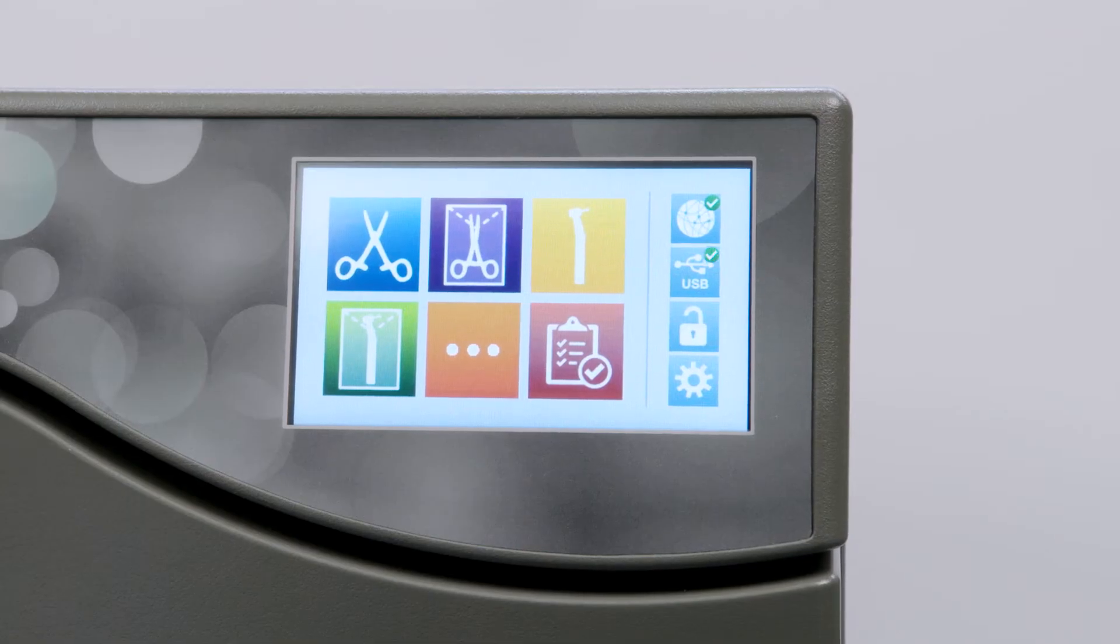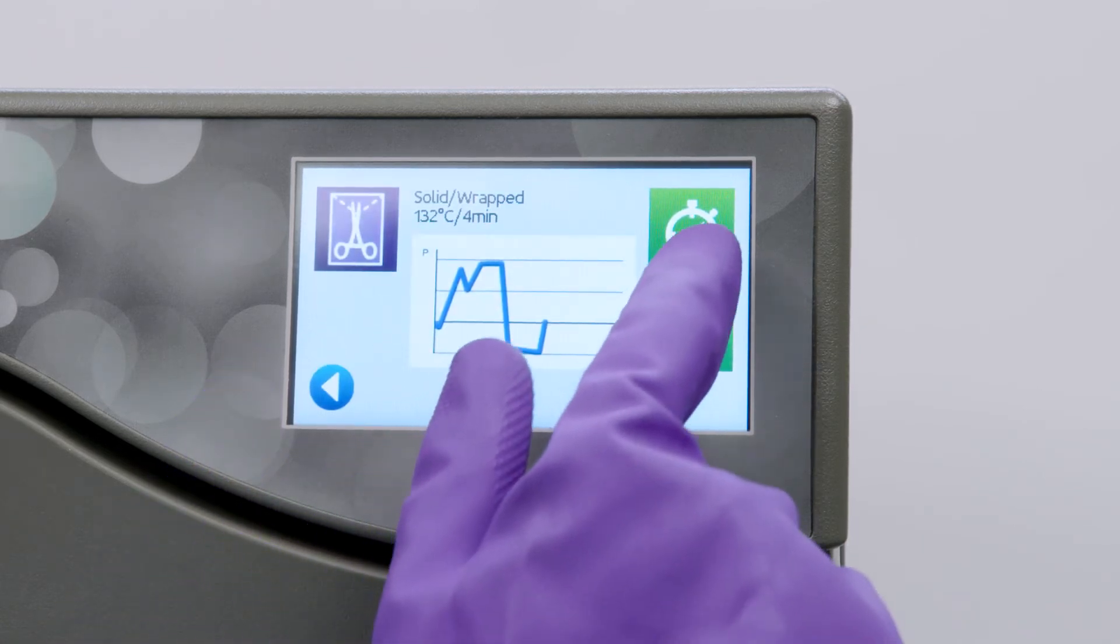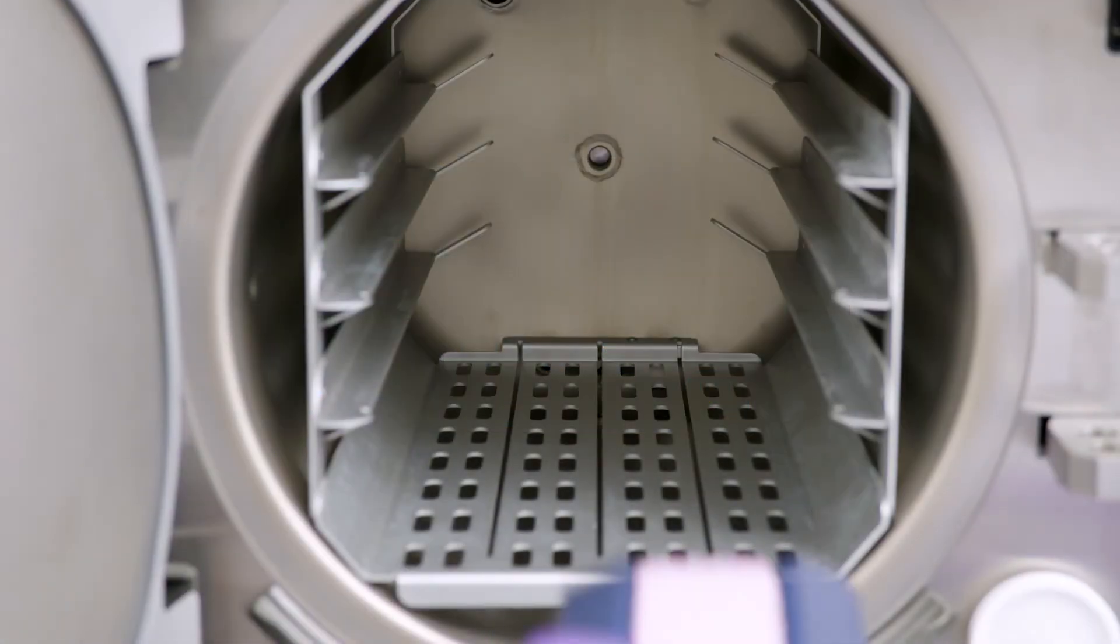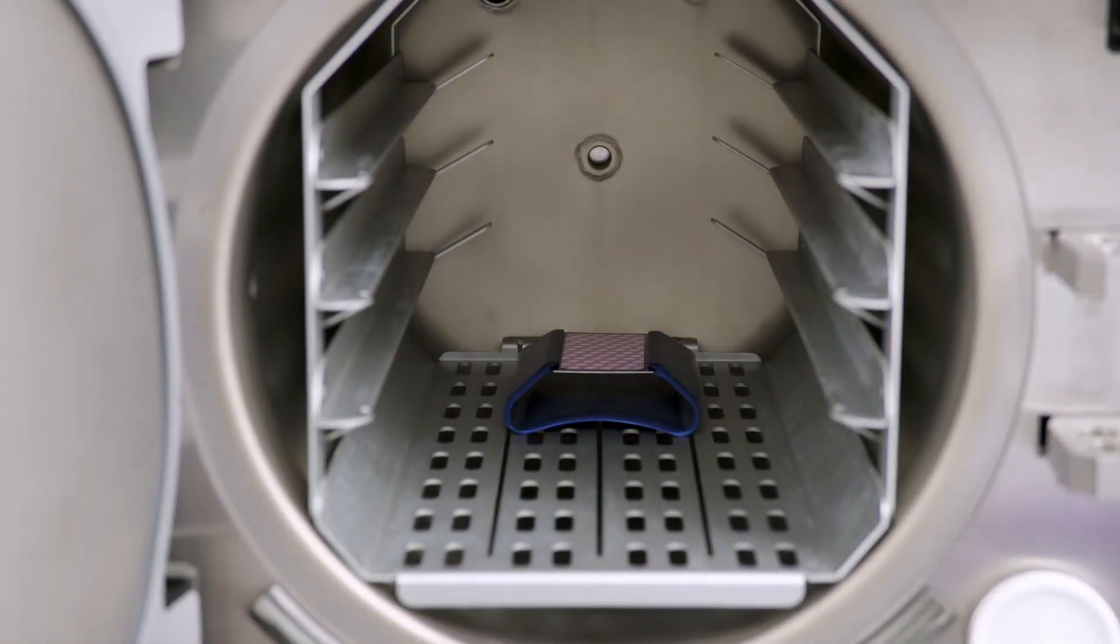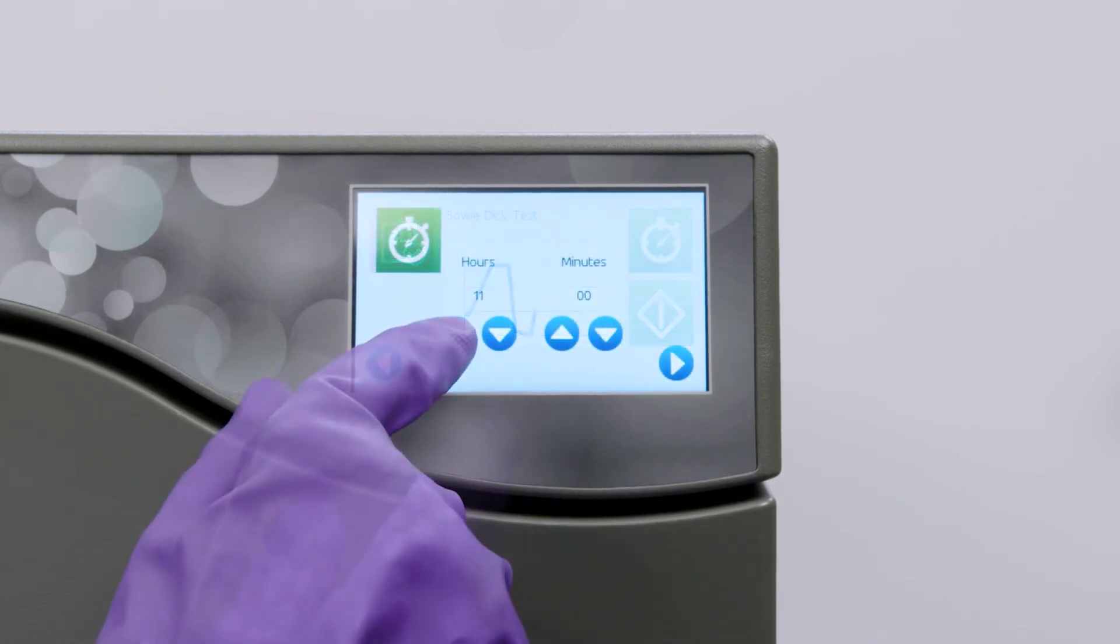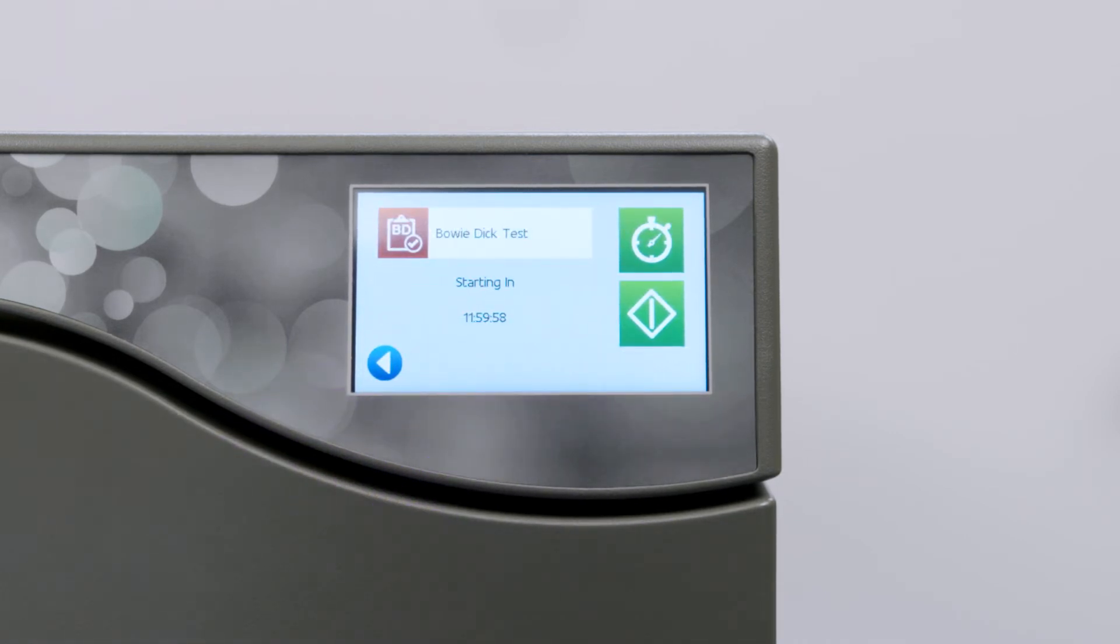If all the conditions of the pre-cycle screen are met, you will not see the pre-cycle screen. Instead, the unit will go directly to the start screen. From the start screen, you have two options. You can start the cycle immediately or select a delayed start, which allows you to set the cycle to start at a later time. The delayed start feature is ideal for offices that need to schedule a Bowie Dick test to run before the start of the day. Using this feature, you can load your Bowie Dick test and set the delayed start to begin prior to your office opening. This ensures your test cycle is complete and you can start running sterilization loads immediately.